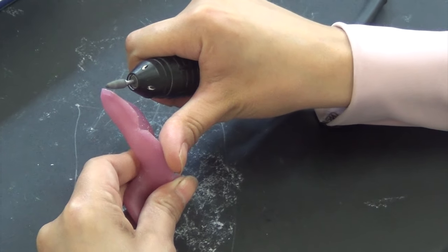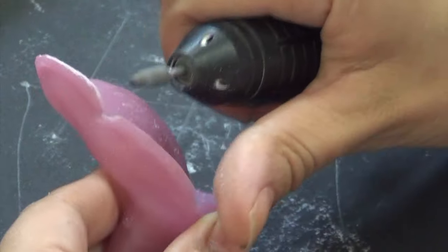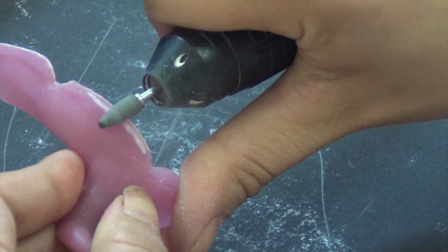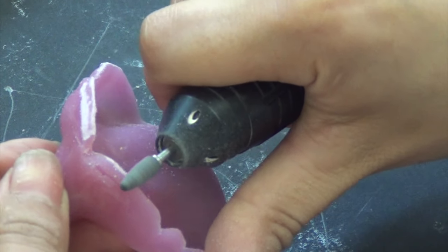When you start finishing the margins of the tray, make sure that you are not reducing the height — you are only smoothing the sharp edges. Notice how the technician here is using her thumb as a finger rest.